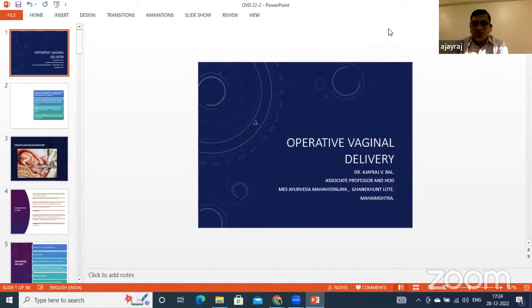If you see the machine, you will see that. And also the vacuum cup has a knob. I have shown that in the video also. I will put that video in our group for you to see it, because today we were unable to hear and see it. But you can adjust the pressure both on the machine and on the vacuum cup.